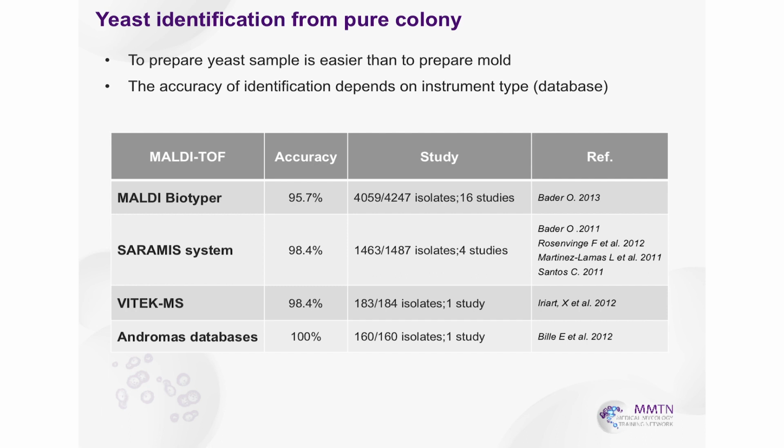But for the disease, I'm not sure how aggressive it will be. The accuracy of the identification depends on the instrument data. Here, I have to disclose that I have nothing to do with this company. For each brand, each company, they have a different accuracy.